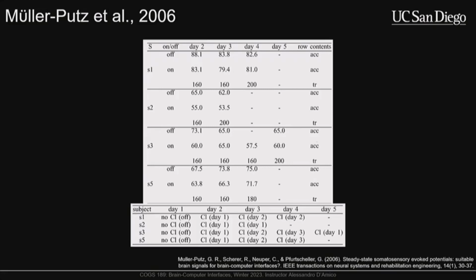This comes from the necessity to record calibration data for our participants because EEG is non-stationary, so the signal is going to change over time. And this actually ends up being a harder problem than what we get in a normal study because usually we're collecting the training data and testing data right there, right then. So we're trying to maximize the relative stationarity within a single recording session. But studies like this, which are multi-session, are not getting any favors by that.